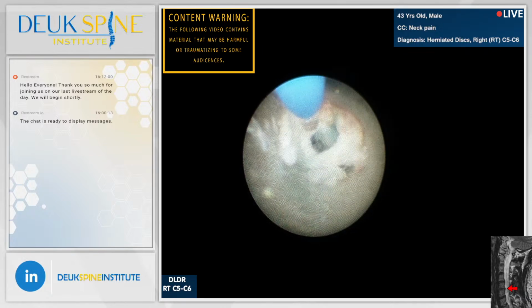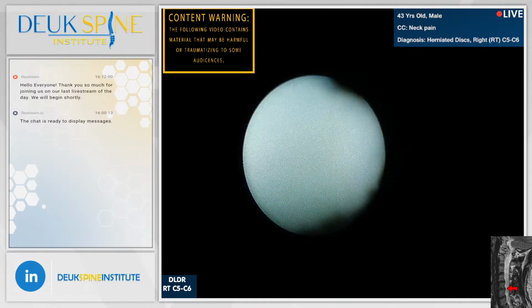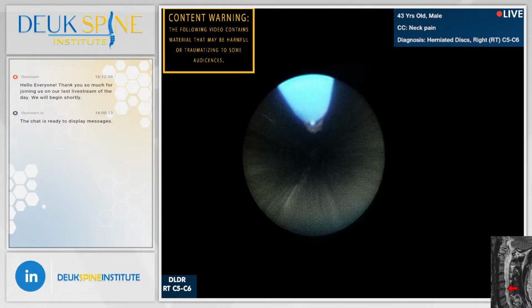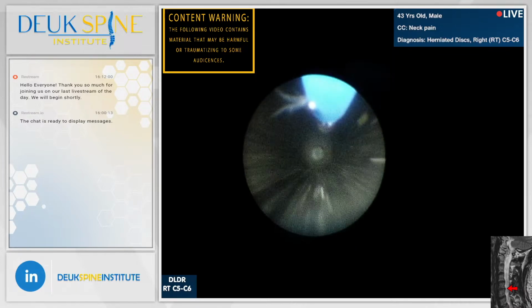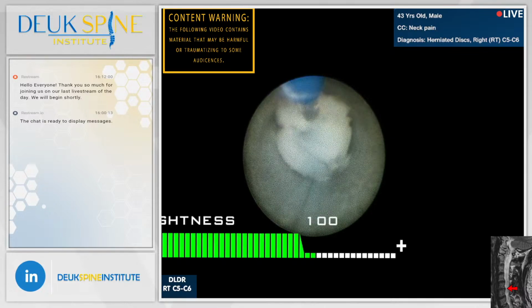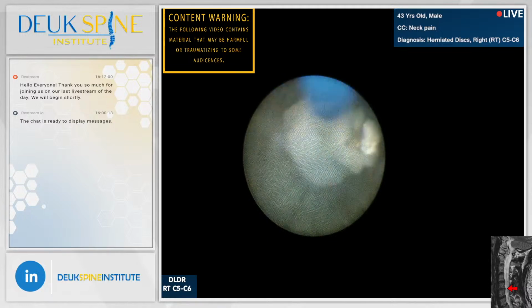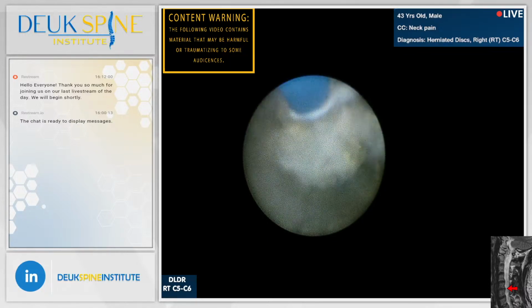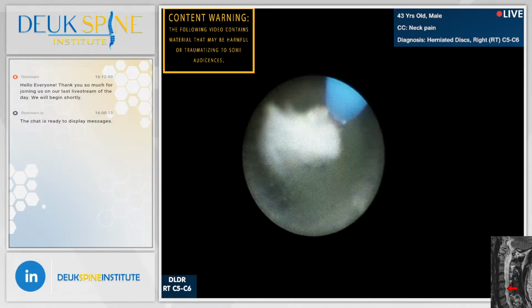Are we ready on the laser? Yes, sir. Now the laser fiber you're seeing, the blue is just a plastic covering. The optical fiber is the glass at the bottom, in the middle. It's a little overexposed. Let's turn the exposure down. Yeah, a little more. Yeah, that's perfect. All right, you guys see the glass fiber, and I'm literally releasing laser energy. 2100 nanometers is the actual wavelength.